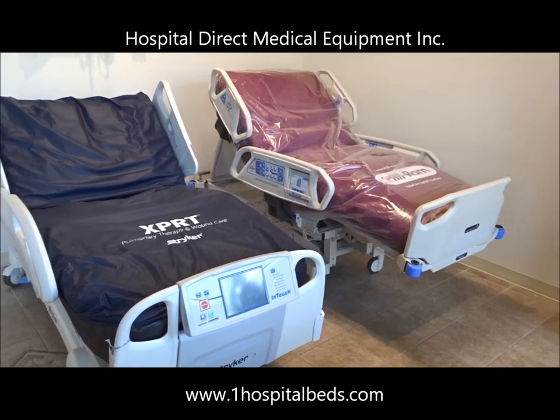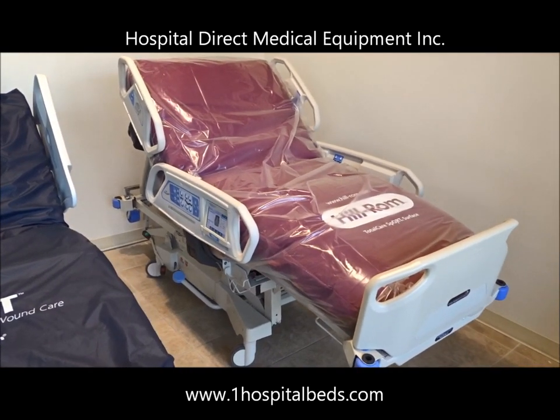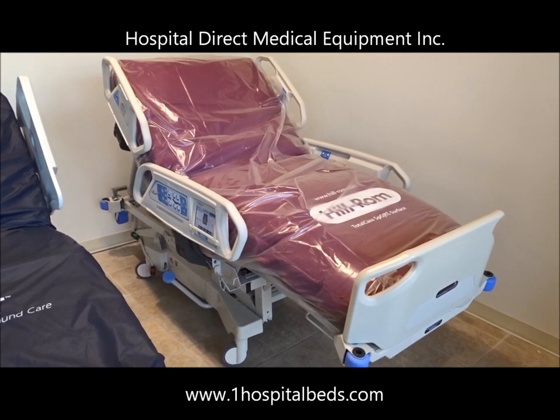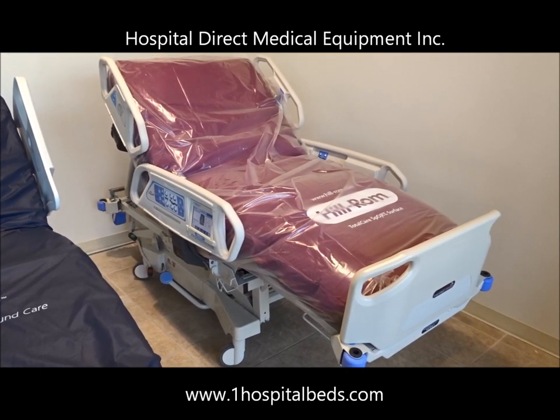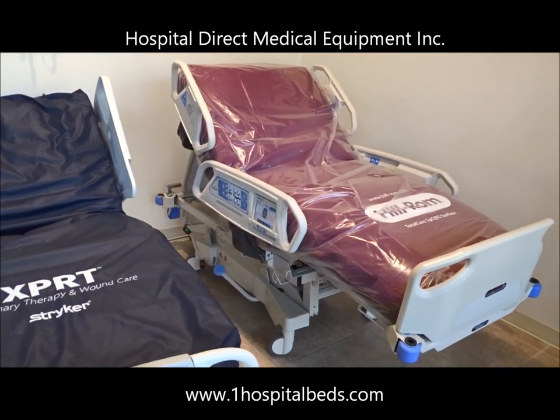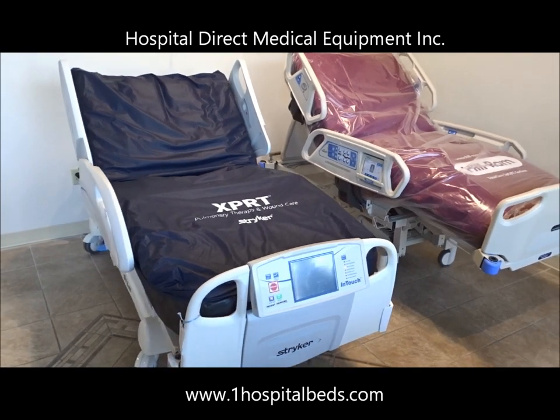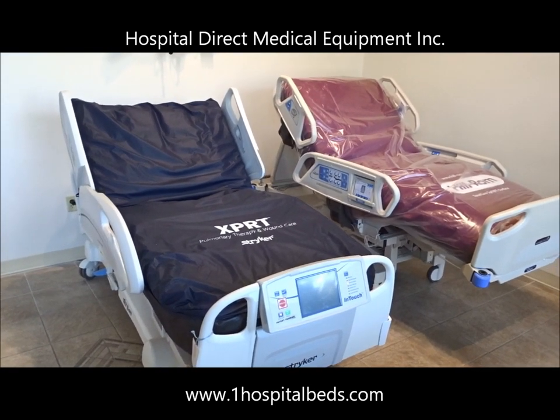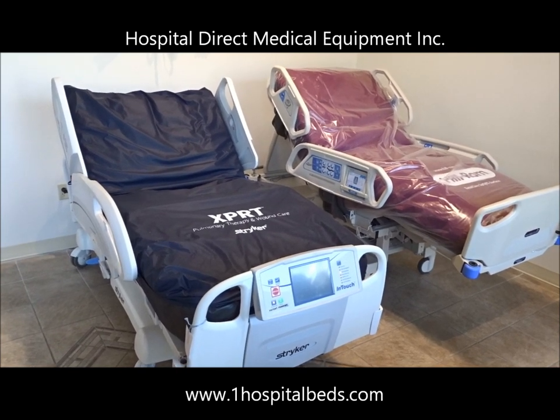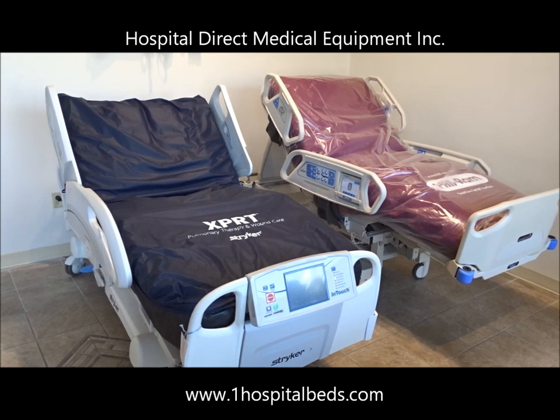The Hillrom P1900 Total Care Sport bed actually sits into a chair position where your feet physically come onto the floor and that footboard does come off and you actually get in and out of bed like it is a chair. So when it comes to the differences of those two particular beds, the main difference is that the Hillrom Total Care Sport will have a full chair position to get in and out. The Stryker InTouch bed will have a chair position, but it will not be used for patient transition.